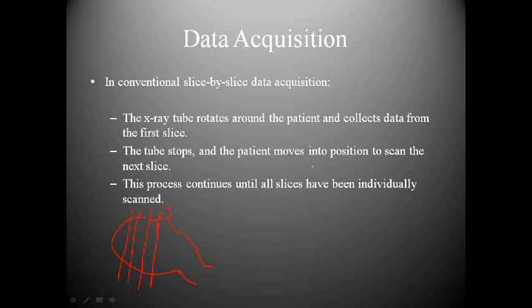The key word here is individually. And so there is not this one constant motion of the patient table moving plus the tube continuing to move, but each slice is acquired individually, and pretty much it'll take a longer point in time to do this.